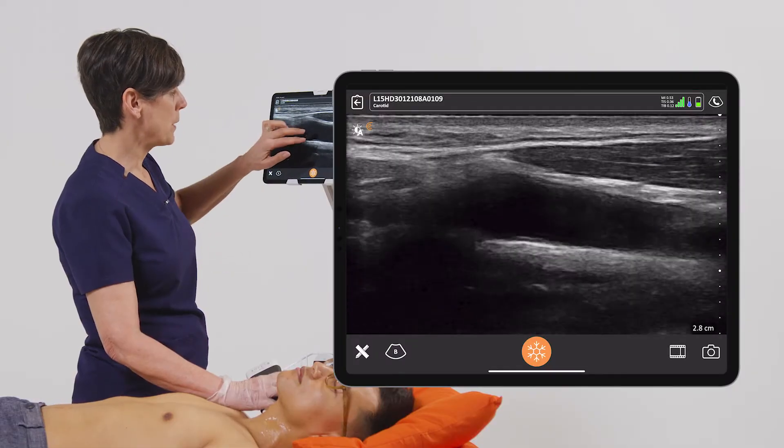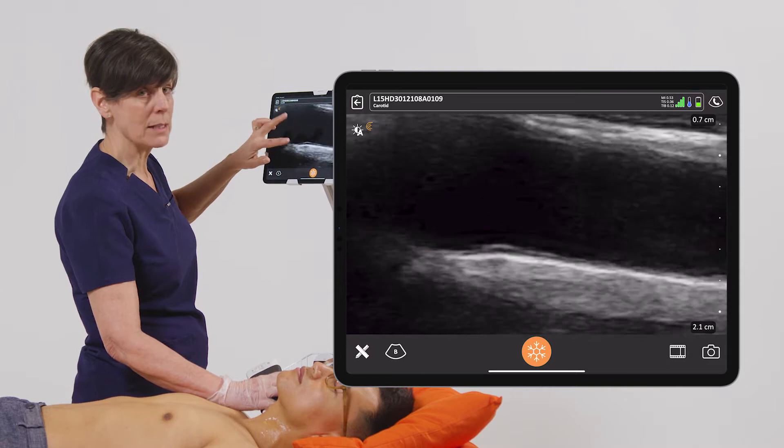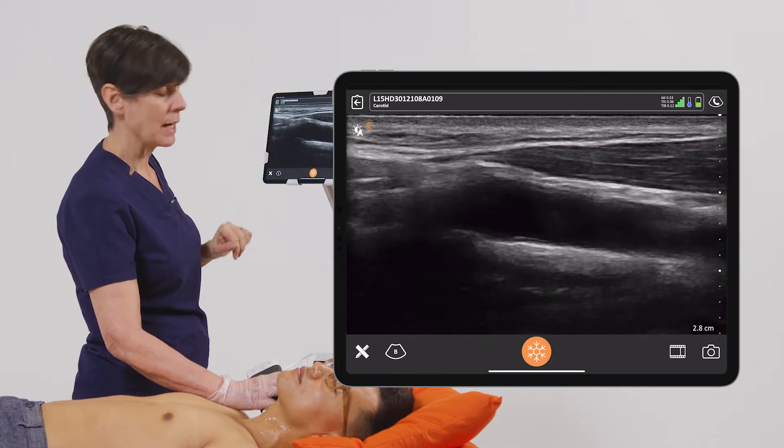The next kind of zoom is called a pinch zoom, so I'm just going to pinch the image apart at the area that I want to see and I can make that as big or as small as I like, and then I can take it back down by pinching my fingers together.